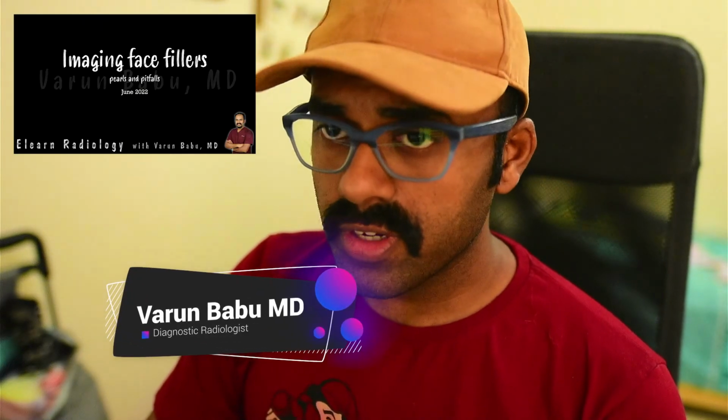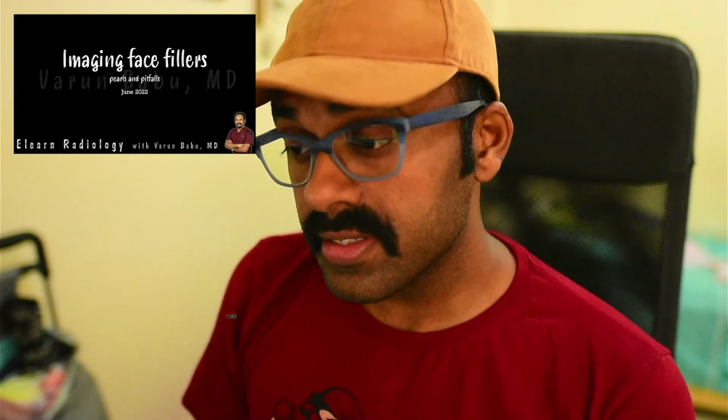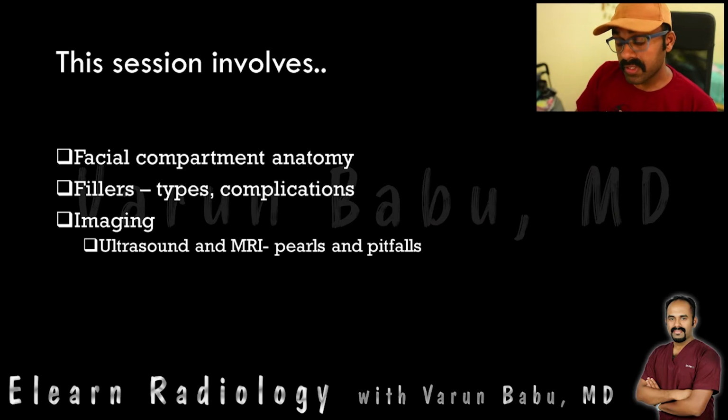In this session, we are going to discuss imaging facial fillers. First, we look at the facial compartment anatomy, the types of fillers, their complications, the imaging tools that we have at our disposal, the ultrasound and the MRI, the pearls and pitfalls in using them.